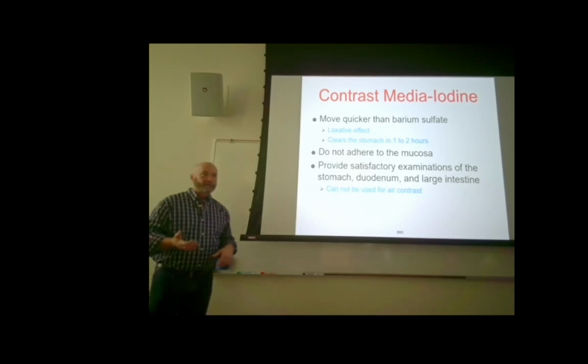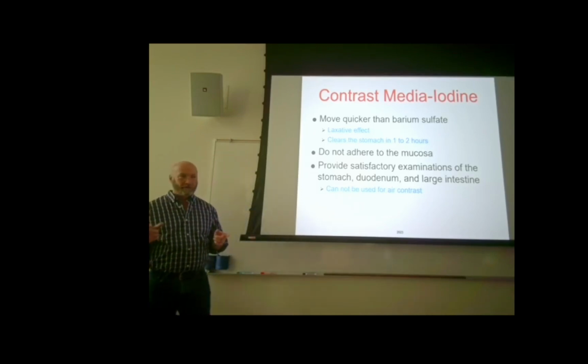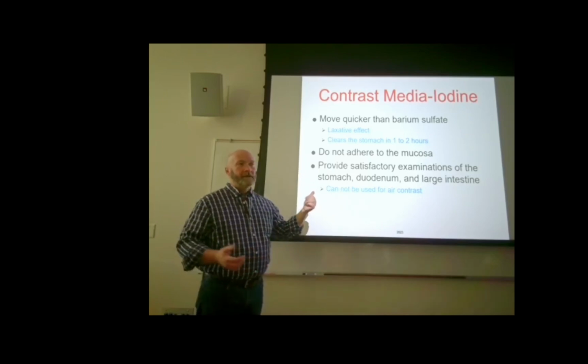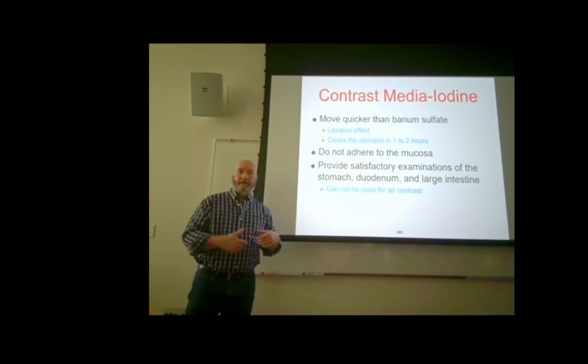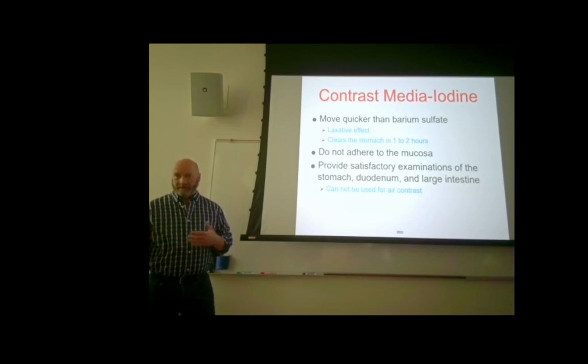I've seen techs that would take a little bit of Gastrografin, if they had a partially used bottle, and they would empty some of that into the barium mixture, just a little bit, not enough to dilute it, just to have that laxative effect on the barium, to get through the patient's small intestine to the colon quicker. I'm not saying I recommend you do that. I'm just saying don't be surprised if you work with a tech that does that every now and then.